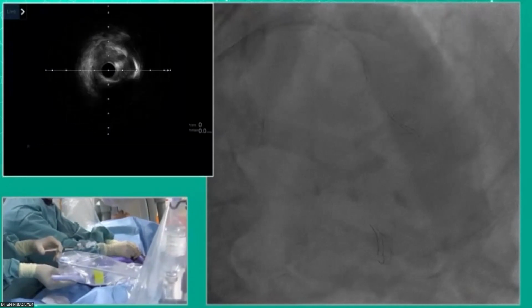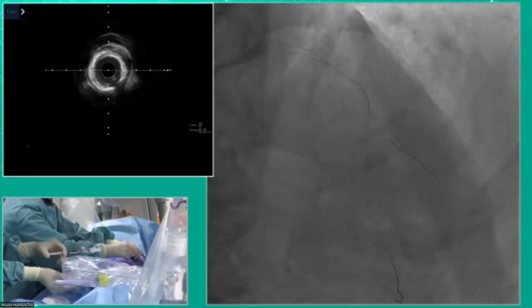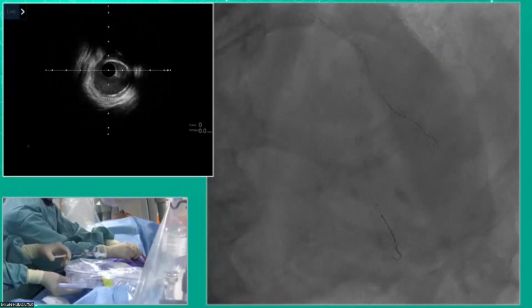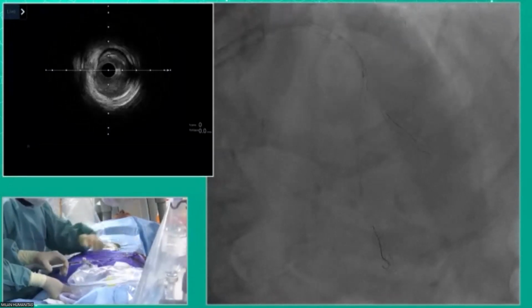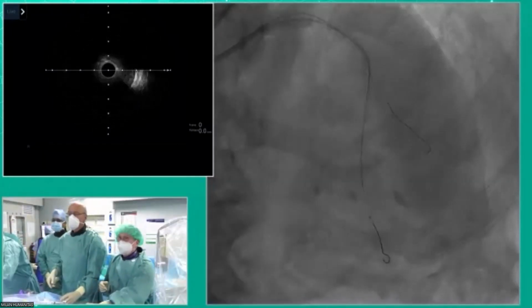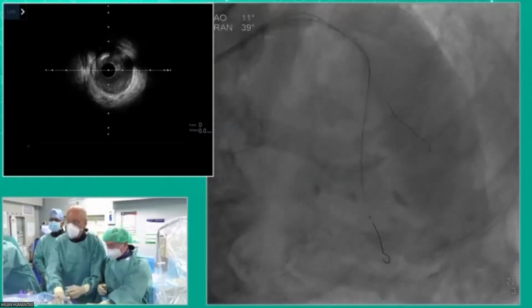Yeah, I think, Antonio, your point is when you do this much work and is this diffuse disease, sometimes the IVUS, you know what you're going to see. It's going to look dissected and all kinds of things going on. Yeah, and planning not a little stent. You can be efficient in not doing this stent. But it'll be instructive for the audience.